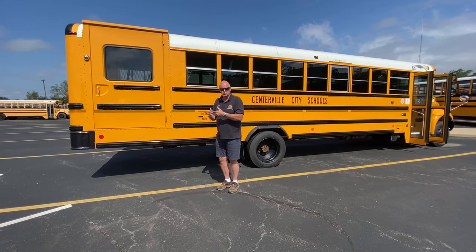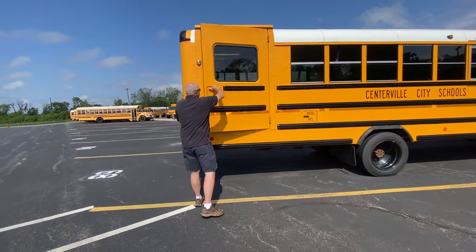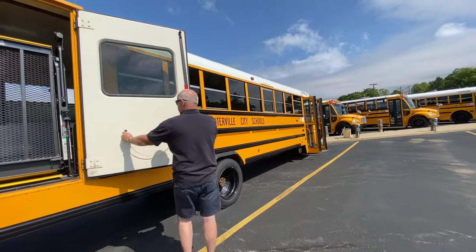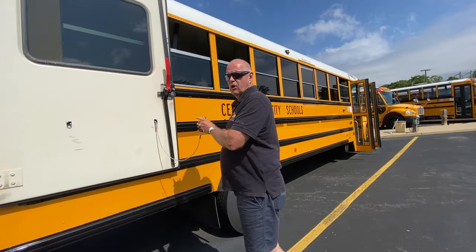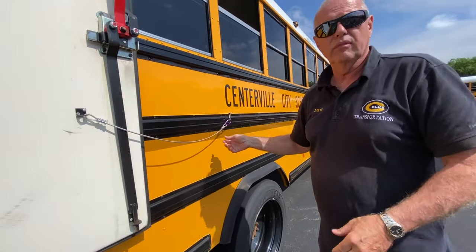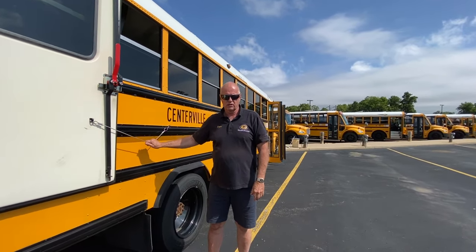First thing we want to do is when we come up to the door, we want to open the door and every time, please secure your door — latch your door open. You don't know when there's going to be a freak gust of wind, a truck go by, whatever. We always want to latch the door.